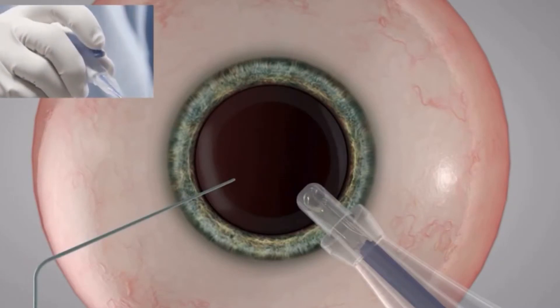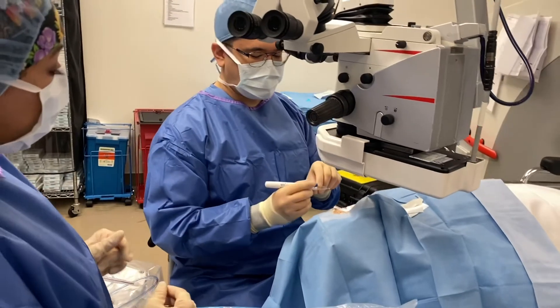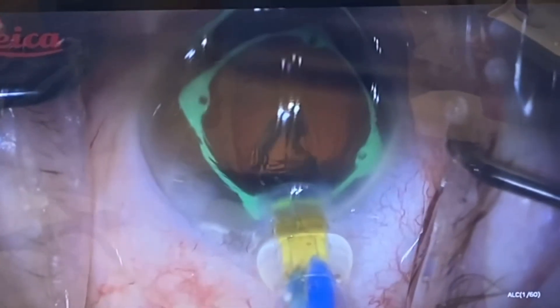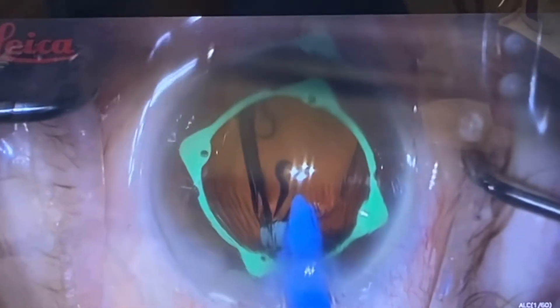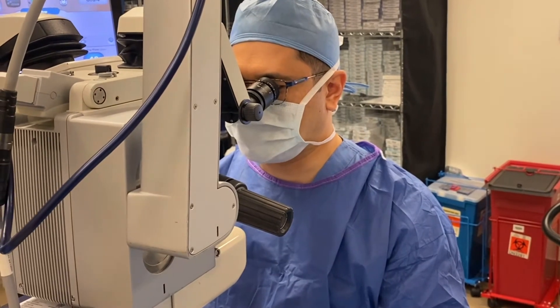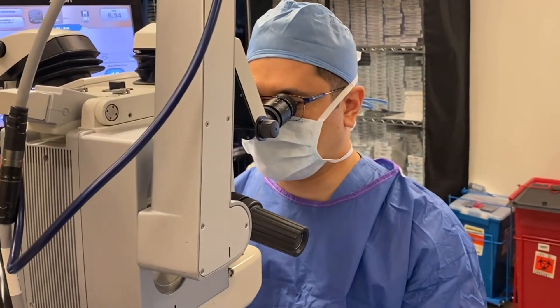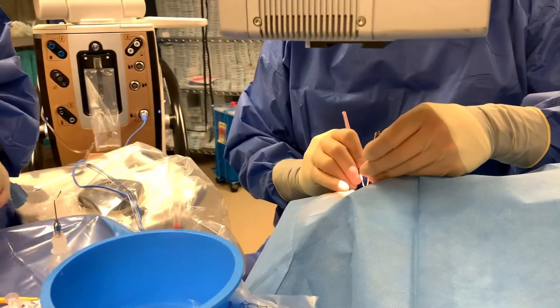There's a big difference between the old system and this new autonomy delivery system in that it only takes one hand with the new system. With the new Clarion lens snapped into position, it fits perfectly right in the back. It opens up actually somewhat easier than the SN6 — a little bit faster and it doesn't stick like the other lens.